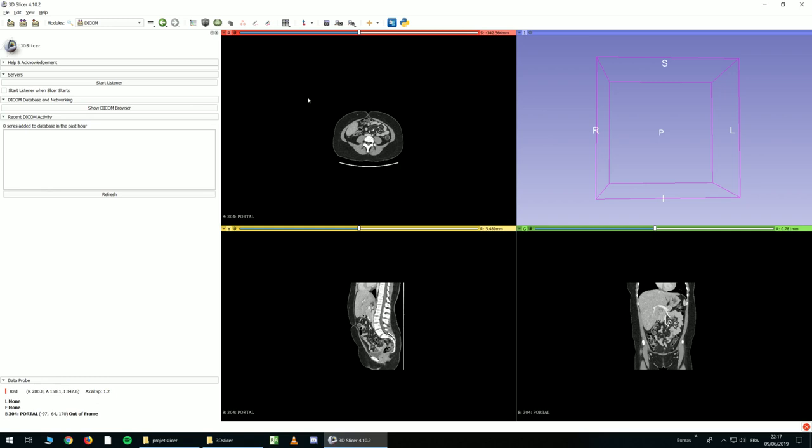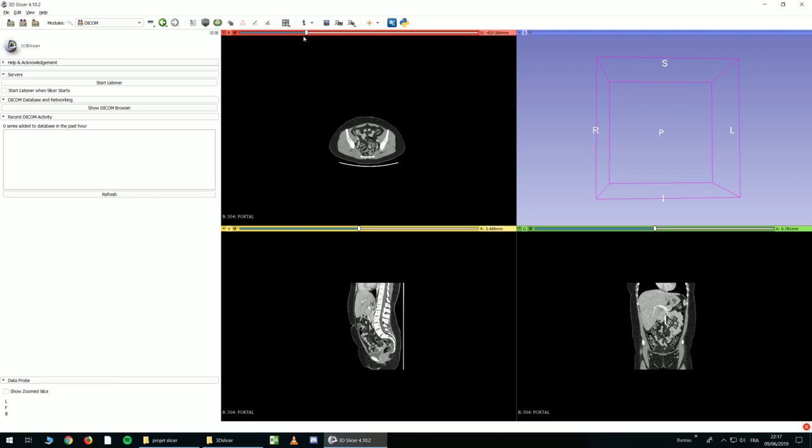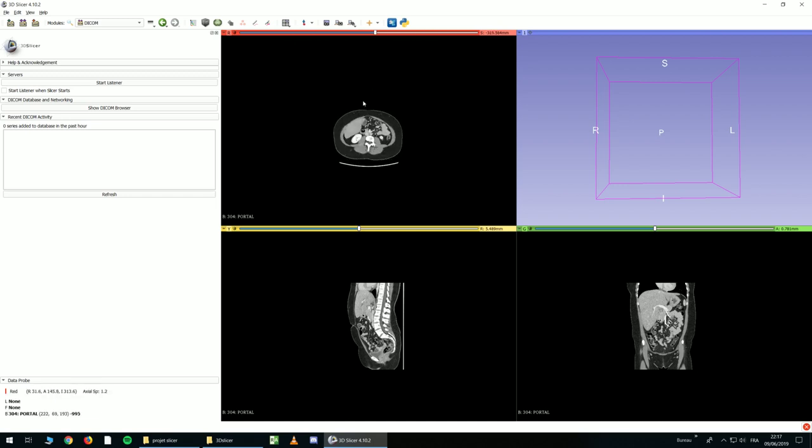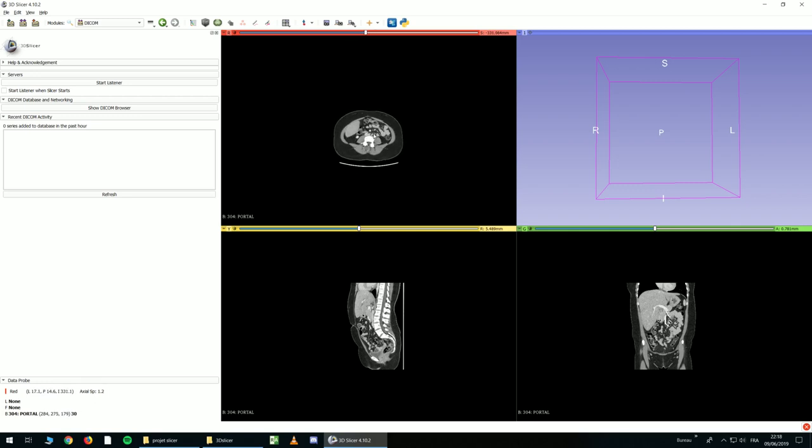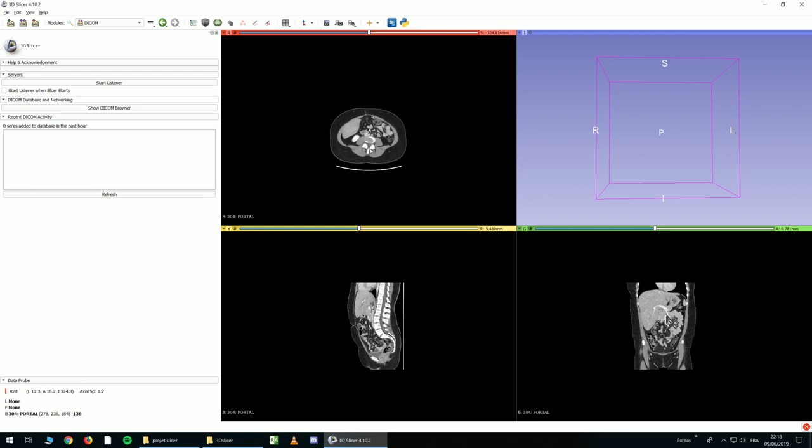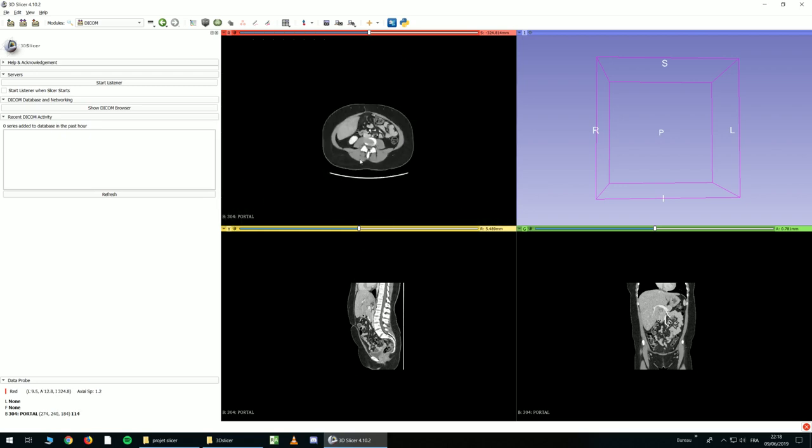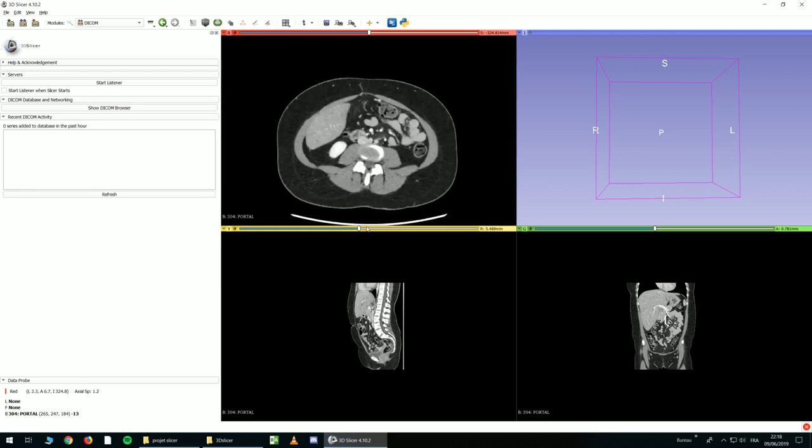And now we will talk about the basic navigation in 3D Slicer. As you can see, it's too small and not practical. So you can use the wheel to scroll, but it's not very practical. If you want to zoom, you can right-click and move the mouse up and down, like this.